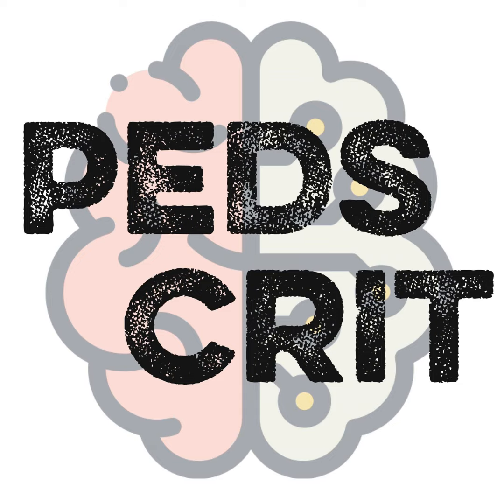Yeah. So generally, when you set your parameters, for a patient who's on VV, like this patient, you are going to initially start going up on your RPMs until you stop getting a lot of good flow increases. So you start getting diminishing returns as you keep going up on your rate of spinning that disc, right? Because you're not getting enough preload to the circuit to be able to eject. So you push your RPMs up a bit until you start getting diminishing returns, and then you see where your SATs are. And before you decide how much flow you're going to need over the long haul, you're probably going to want to decrease your ventilator settings to where we put them at rest settings.